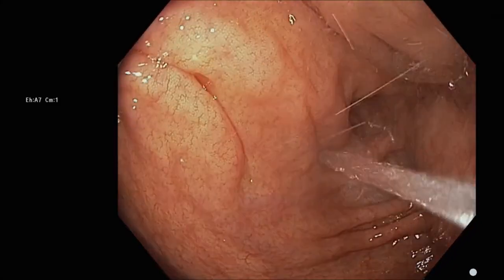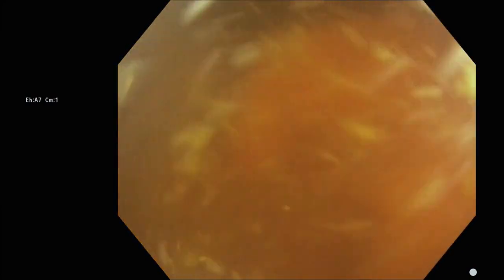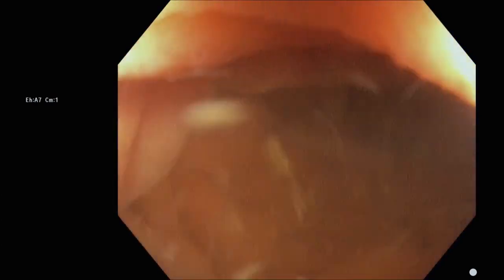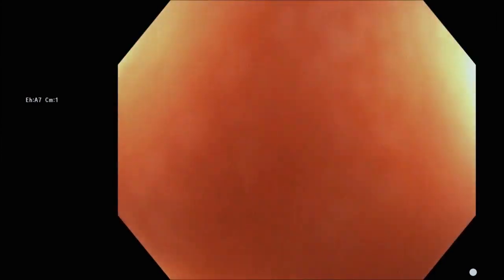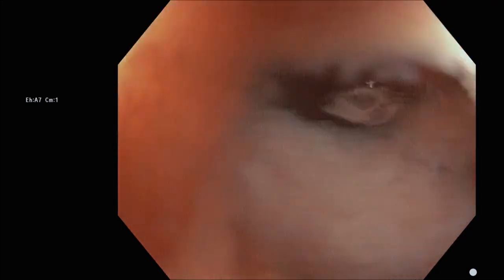So here we have a valve where the orifice is pointed toward the cecum. You can't really see it from the anatomic distal side, from the anal side. So we're taking the gas out and filling it with water. Now, sometimes you have to do a bit of water exchange if the fluid has a lot of mucus in it, but you can see now the valve is much more directly at us, and then we can push our way in underwater. And I think the water often causes the opening to relax a bit. It just allows a bigger diameter to go through.